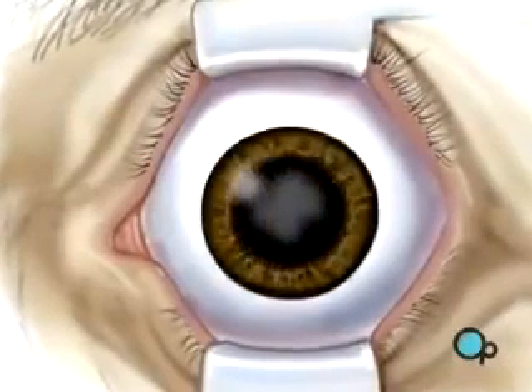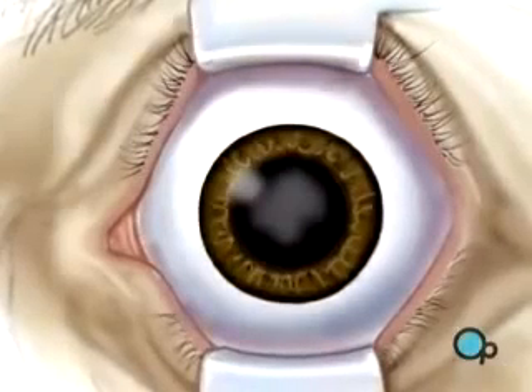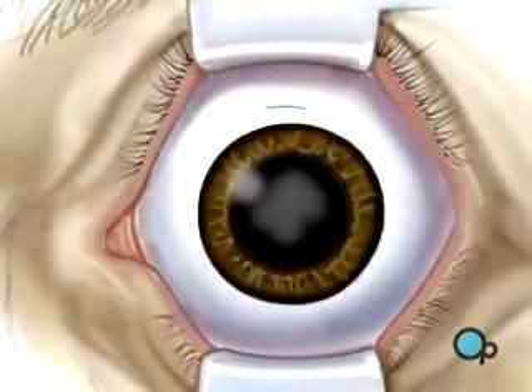By now the pupil will be fully open or dilated. When the operative field is numb, the surgeon will use the microscope to help make a very small incision, just three millimeters above the iris.